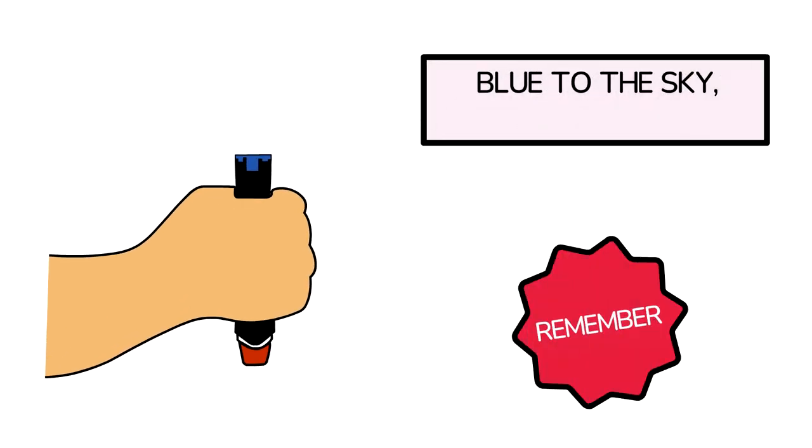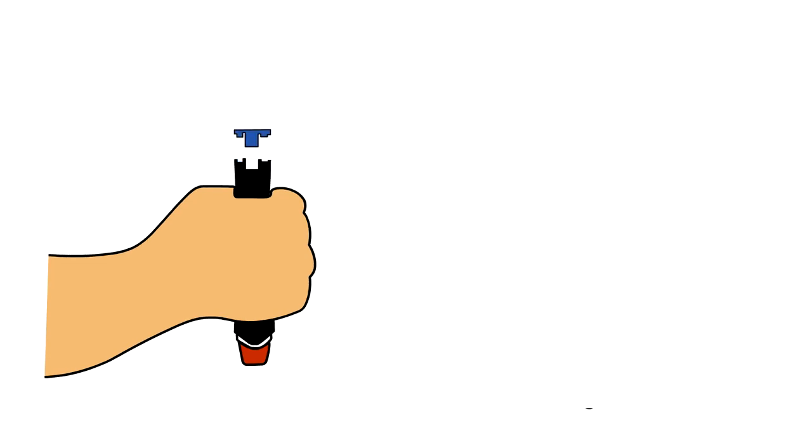When you hold the EpiPen, it's blue to the sky and orange to the thigh. Pull off the blue safety release.